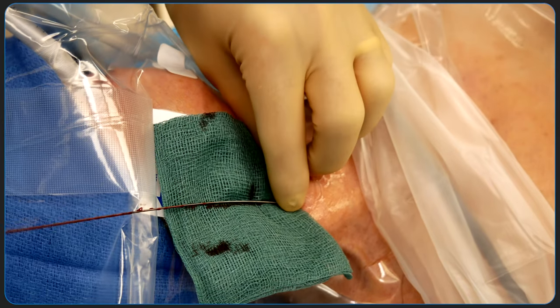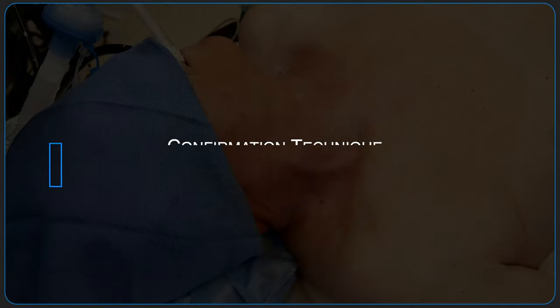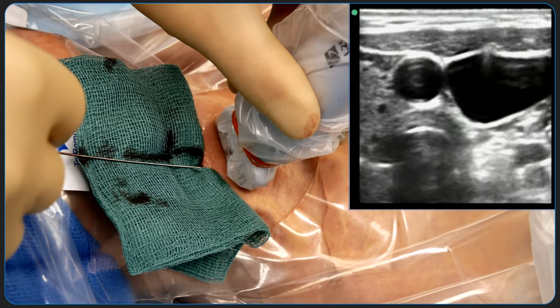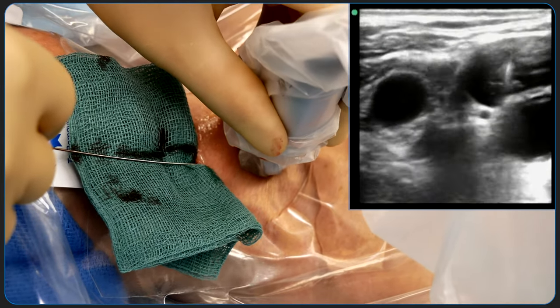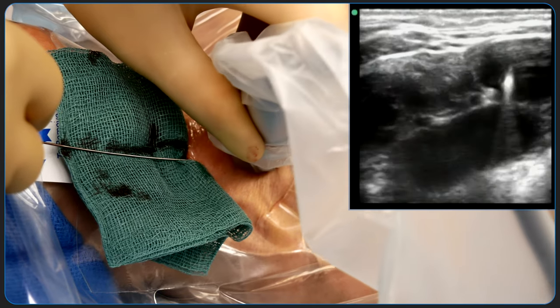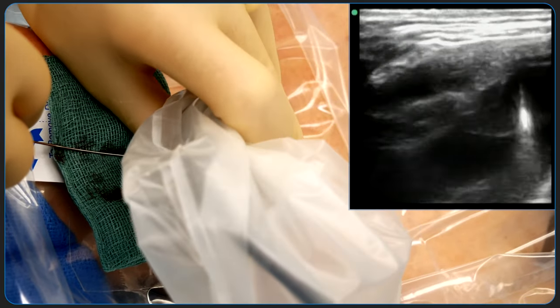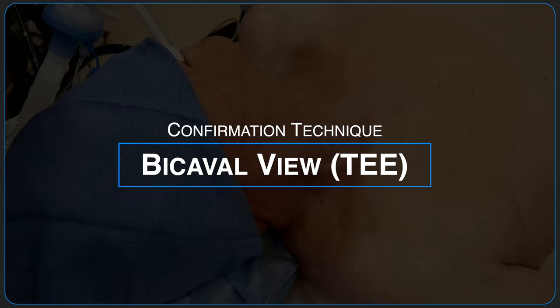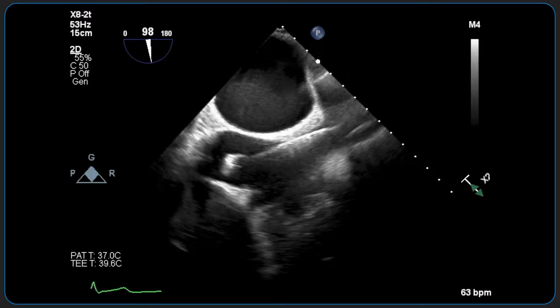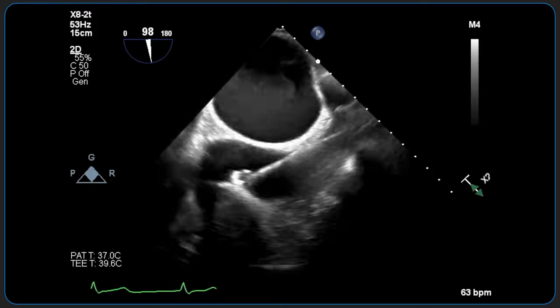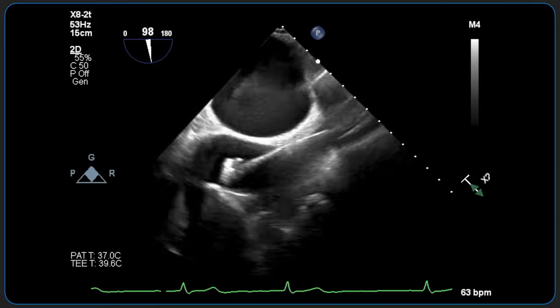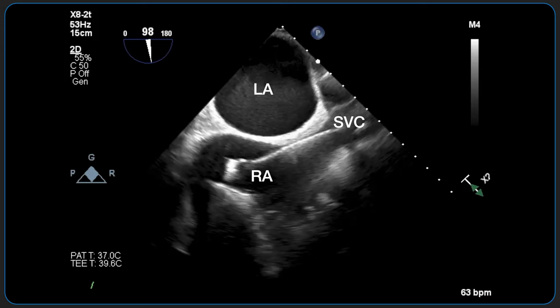The introducer needle is then carefully removed over the wire. Ultrasound can help confirm appropriate guide wire insertion. The guide wire is visualized in the lumen of the internal jugular vein and traced caudally past the clavicle and visualized in the subclavian vein. Trans-esophageal echocardiography can also help confirm placement of the guide wire with a bicaval view. The bicaval view demonstrates the connection of the superior and inferior vena cava with the right atrium. The J-tip guide wire is visualized here in the right atrium.